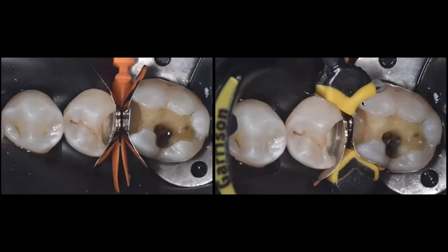Now, when you look at this photo, which I noticed while doing this case, you can see that the band restoring the mesial box of the first molar has much better adaptation than the distal band placed on the premolar. You can see that on the lingual aspect the band is not adapted correctly. The reason this happened is that both of these proximal boxes were very, very large.